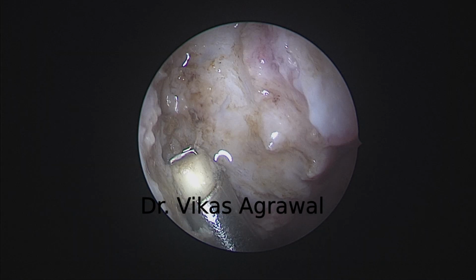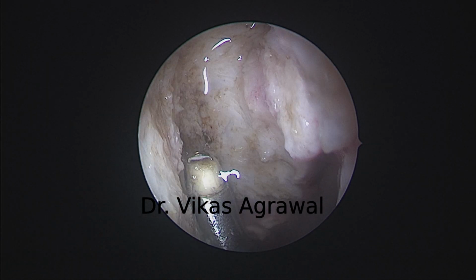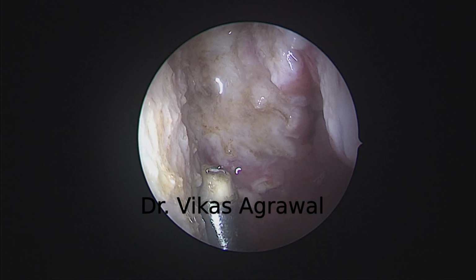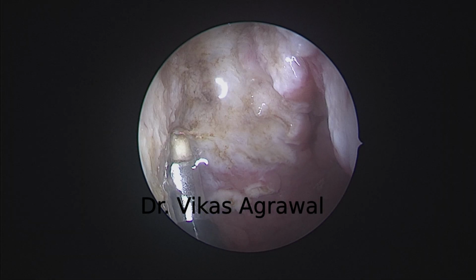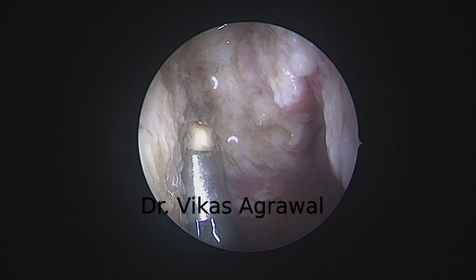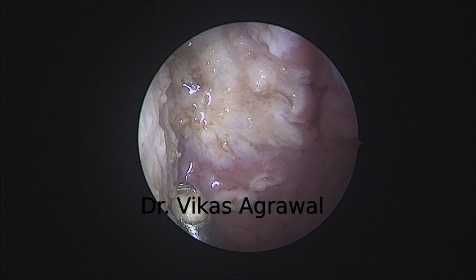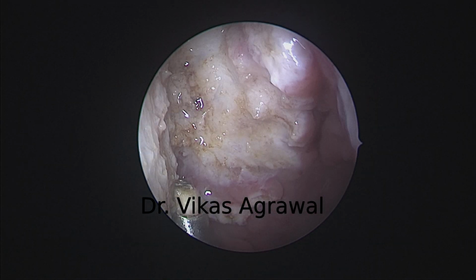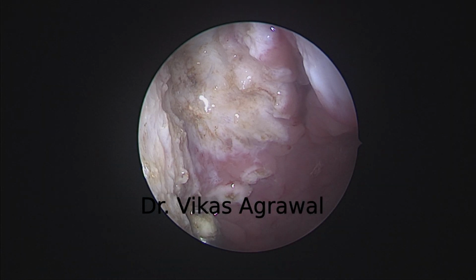And what you will do in a certain case will again depend on a lot of factors, but scientifically, can you conclusively achieve this kind of clearance with another tool?